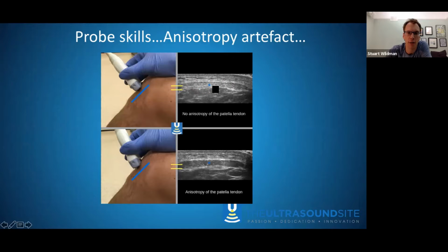It's quite broad actually, and often on courses when we're teaching, people are quite surprised how broad the patella tendon is. But you can see it's bright white, it's nice and healthy, much to my relief. But if I then move my probe off that perpendicular angle to the blue line or tendon, it turns dark, or hypoechoic as we term it within ultrasound. And that can often be indicative of tendinopathic change. It would be unusual to have tendinopathic change at this point in the patella tendon, and when you become more experienced, you sort of appreciate that. But it could be termed and could be judged as that, given that image.